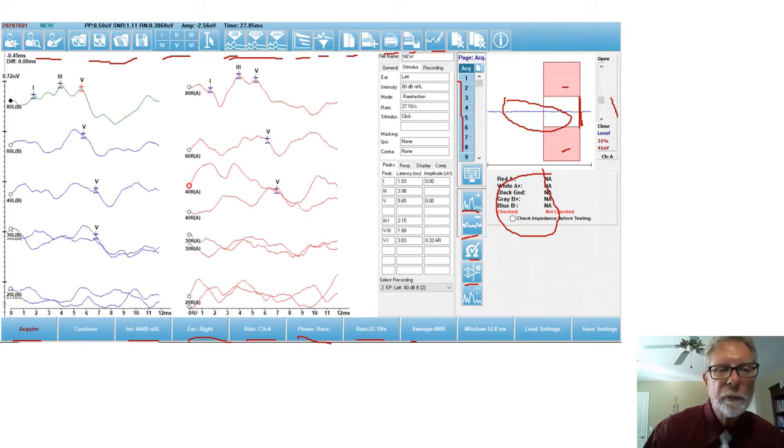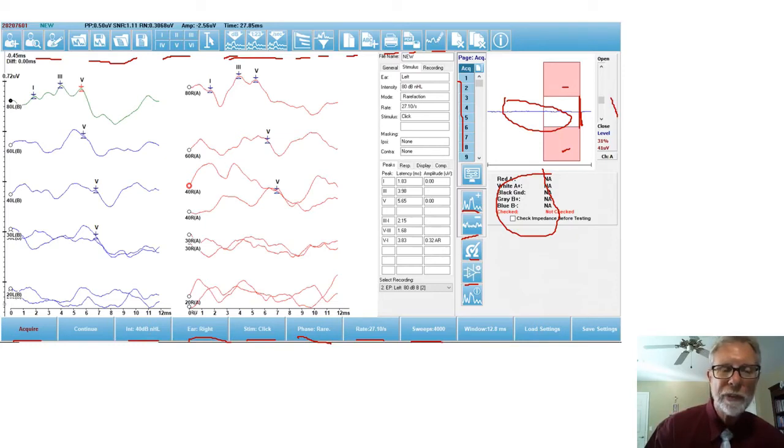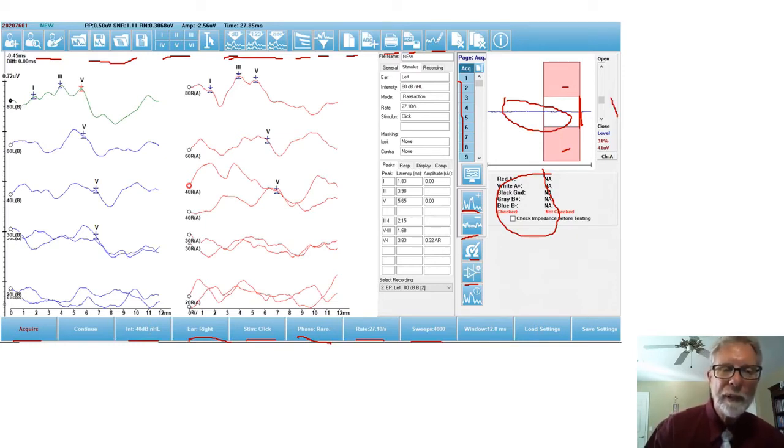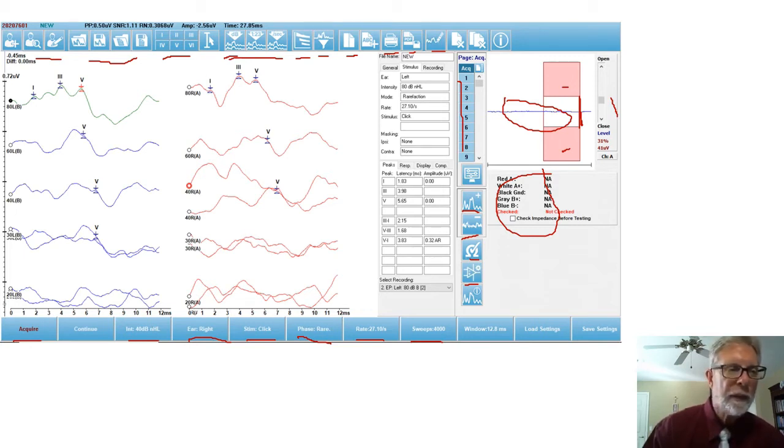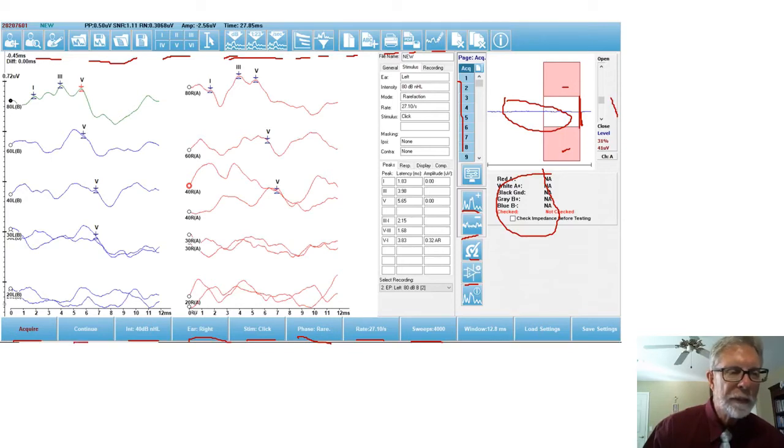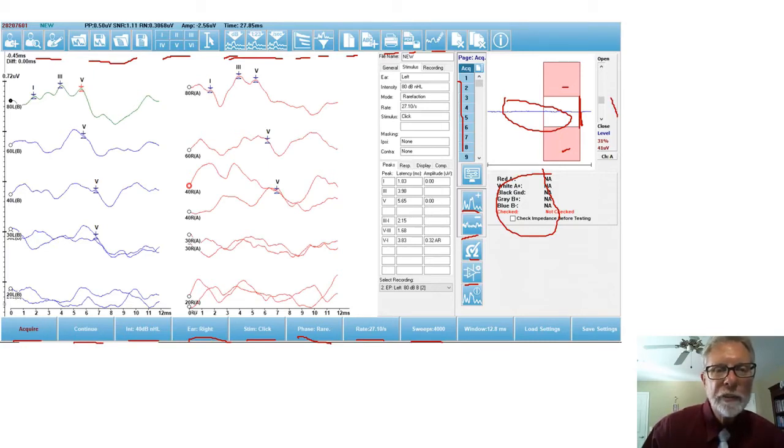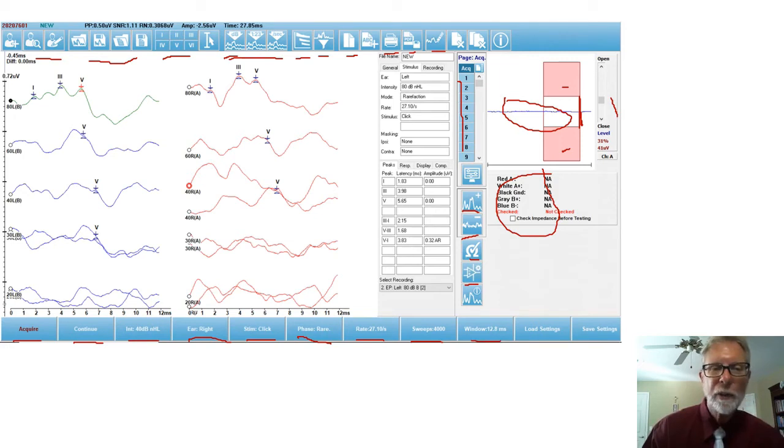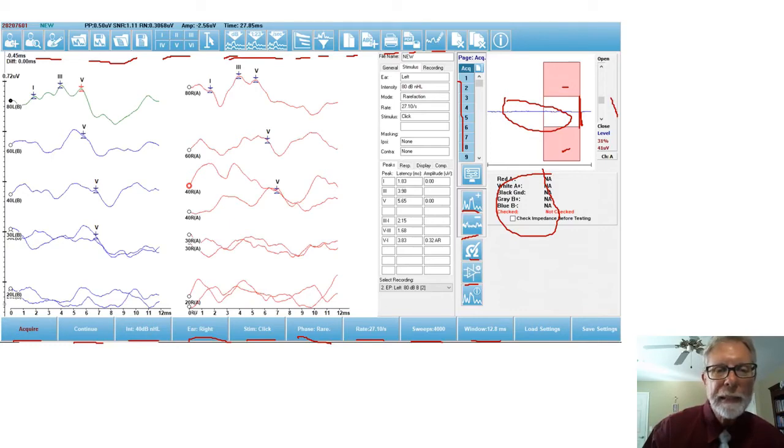This is where you would change the rep rate if you wanted to. Here's where you would specify the number of sweeps before the system started. And once it stopped at a given number of sweeps, say 2000, if you wanted to continue, then there's a button to continue past that. And of course, you can stop whenever you want. This is the window, the window in which we recorded it. I have it on 12 milliseconds, but naturally you can make it anything you want.